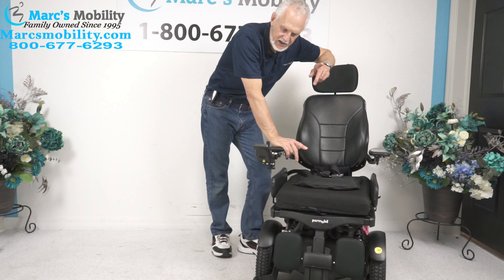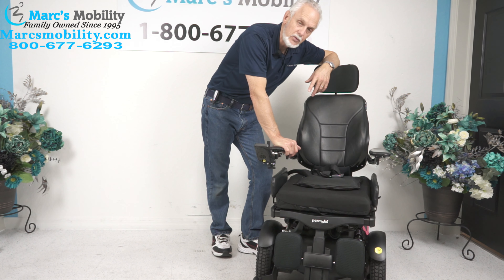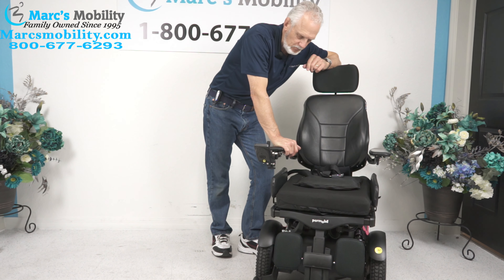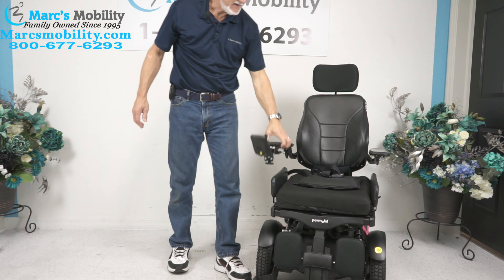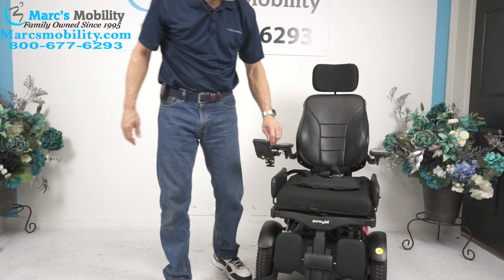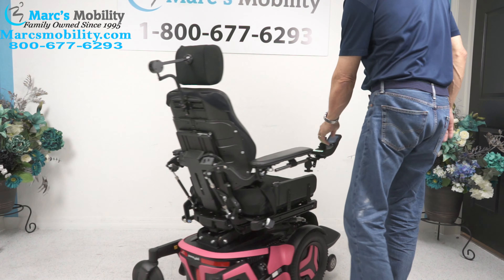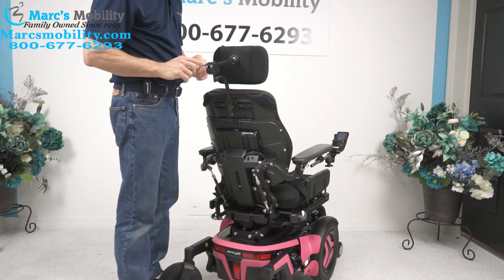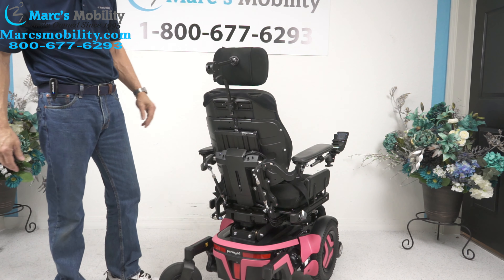Now this chair is pink. If you want this chair but don't want it pink, just let us know — we'll be glad to see what we can do with the color because we have different colors available for this chair. It's a high back. The arms do flip up. The joystick can go on the left side with no problem. The back of the chair has a headrest that's adjustable — just by moving these screws you can adjust the tilt of the headrest.